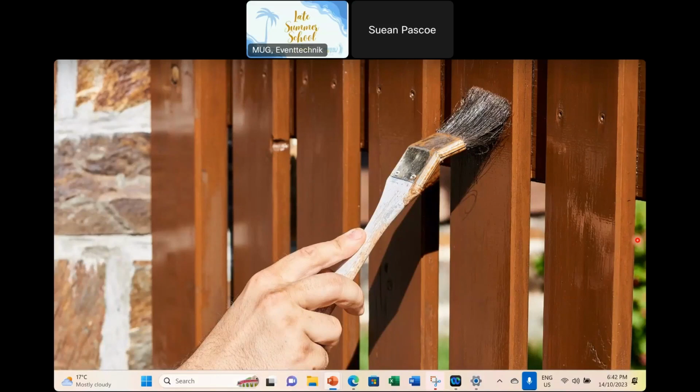And we're going to use a paint the fence kind of technique. I don't want you to just plonk your probe down and expect that the pathology is going to be under your probe. You actually need to paint the fence and scan through the area so that you get a view of the region. You're looking at the right upper quadrant, not just the mid-axillary line. So whilst that's our starting point, we're then going to paint the fence and do brushstroke motions to get a view of the right or the left, wherever we are, to get a view of that region rather than just one spot.